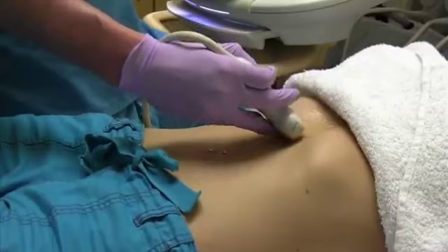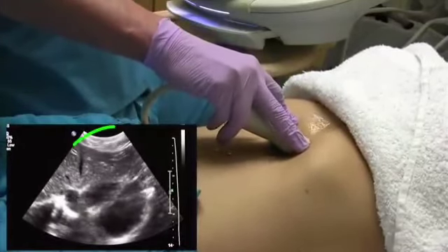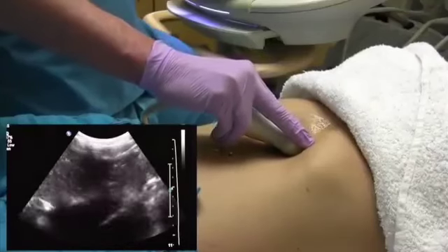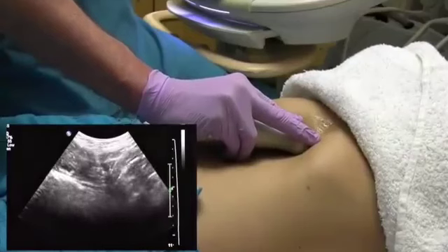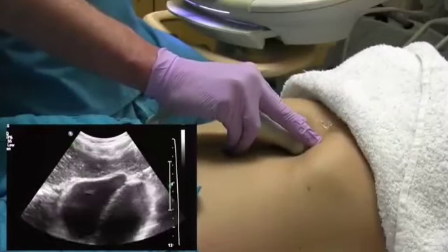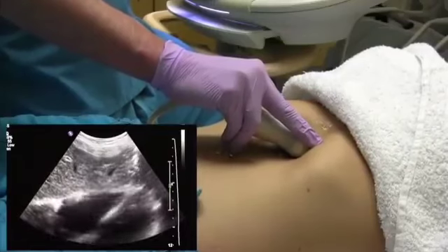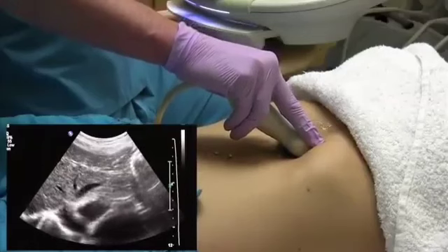Next we go to transverse, and for that we're going to start again with the left lobe, subxiphoid, and you kind of grab the top of the probe here, and you want to make sure you sweep all the way up through the left lobe till you see the heart. And then as you come down, very similar protocol, you start at the top of the left lobe with the parenchyma. Coming down, you'll see the hepatic veins.